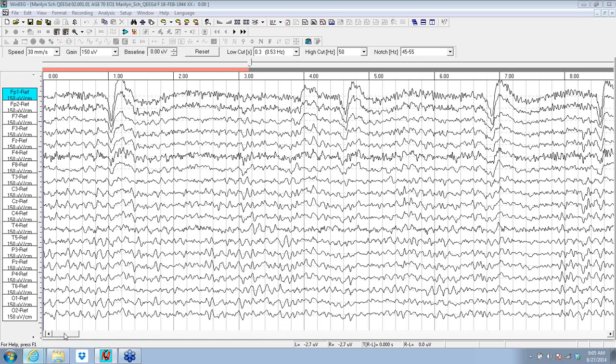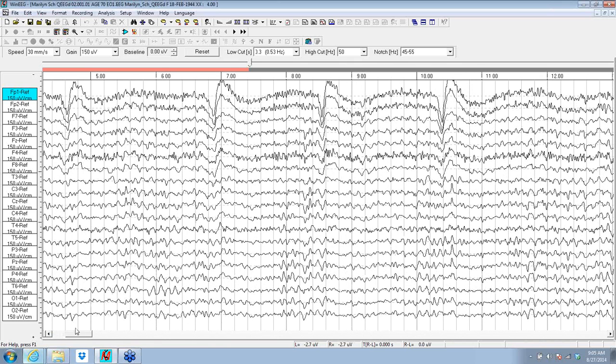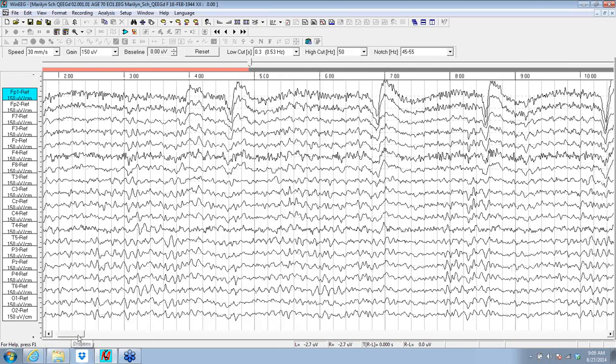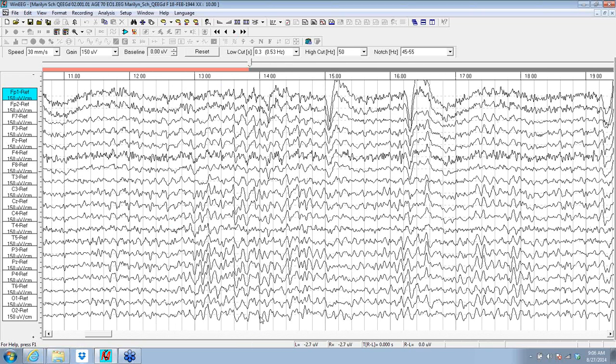And as we start to go through the raw EEG, you're essentially looking at eye blinks up in the front. Now, if we were to process this, we would end up having to cut those out and throw away the EEG and the eye blinks. And obviously for the first bit of the EEG here, this is pretty much all throwaway. And then we see this widespread event.